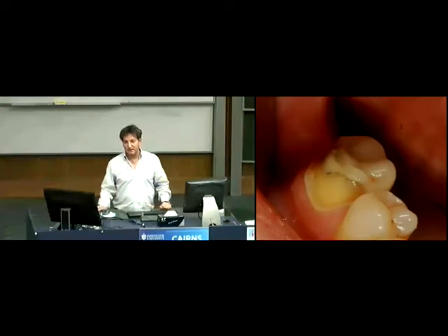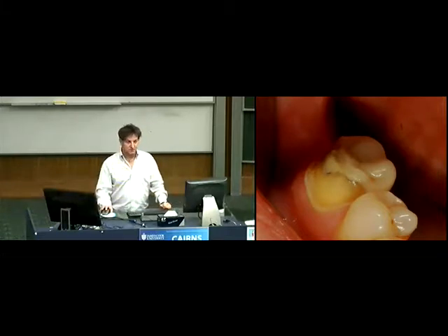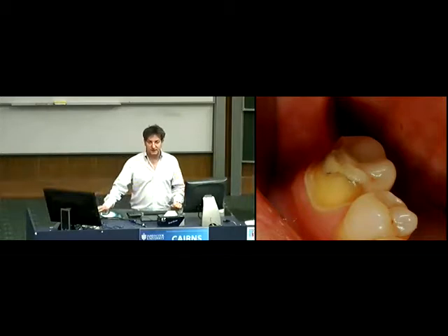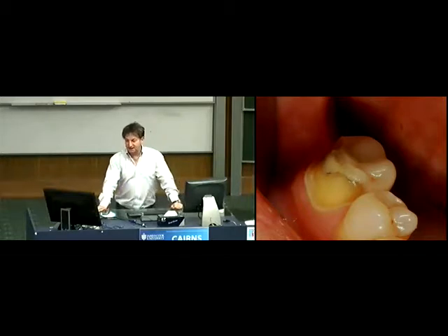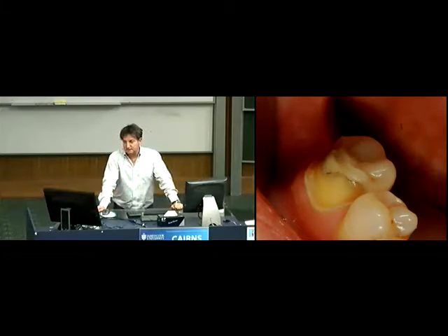Now, why did something like this go wrong? Sorry? Yeah, it's a little bit sharp there, but at least we've got enough axial reduction. We've got a shoulder that's pretty well defined. You look at that and I sort of think, I mean, I get these things come in. Somebody put an Emax crown in a male of about 110 kilos with no posterior tooth. Now, is there anything wrong with that? Would anybody actually sort of think this is an idea for an all-ceramic crown?